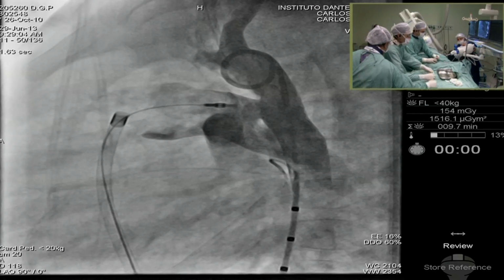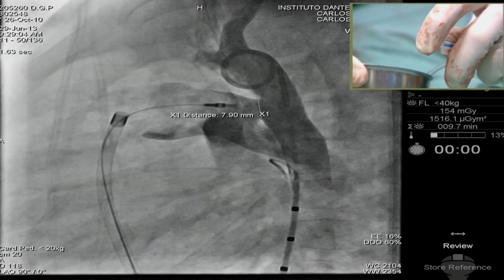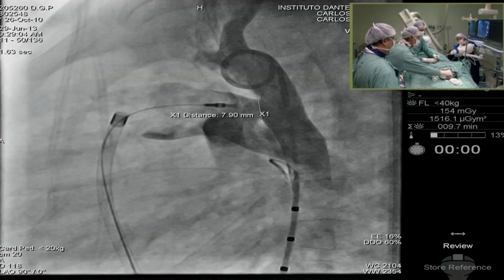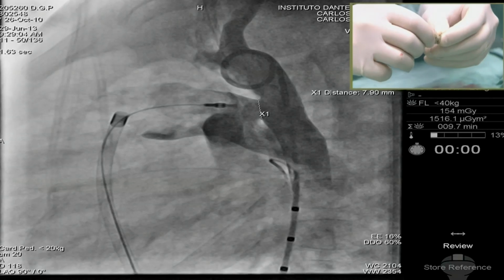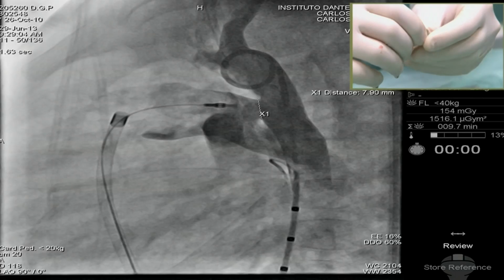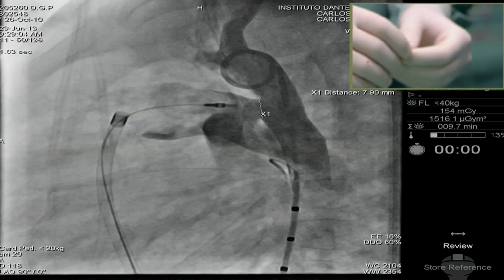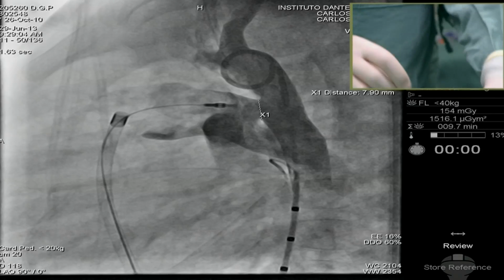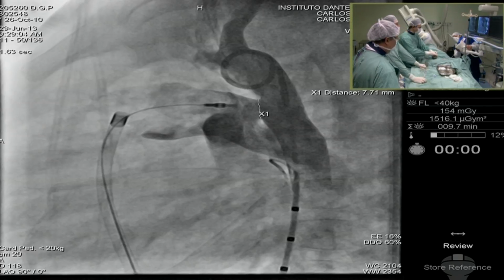All right, there's a question or a comment over here. Yeah, Robert Chen, I'm from Halifax, Canada. Carlos, I just wondered, with this kind of a device, do you really need to oversize it at all? Given the configuration, would you not just say that it's a 6 millimeter duct and put in an 8.6? Or even a smaller device? Is it even necessary to oversize?